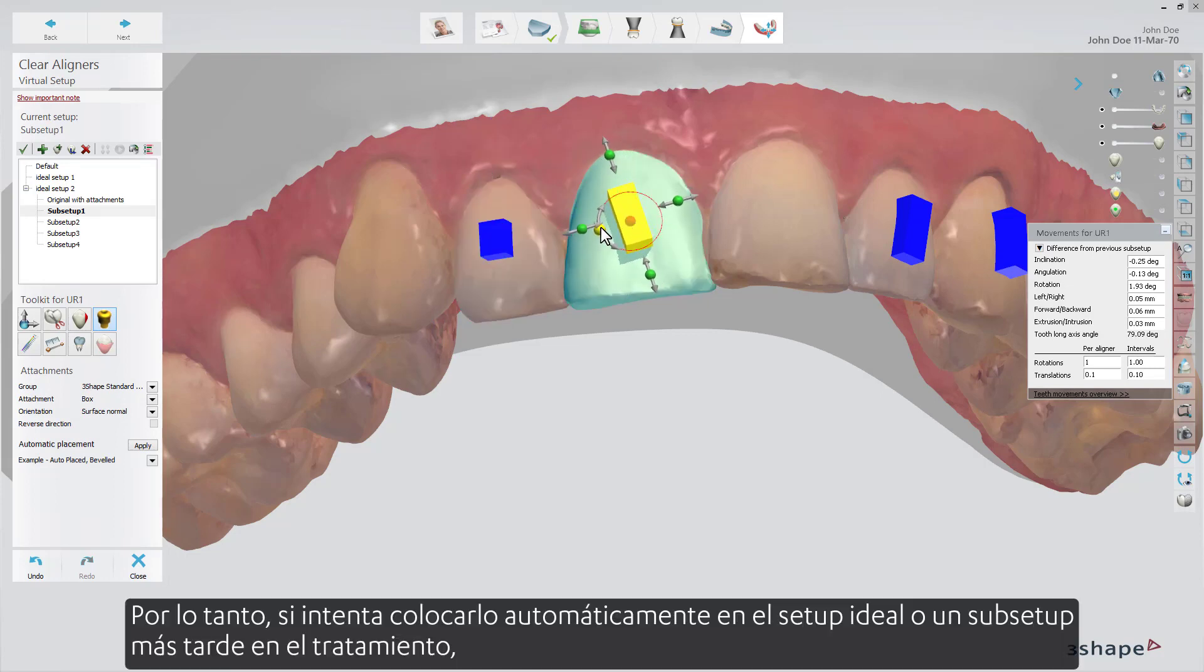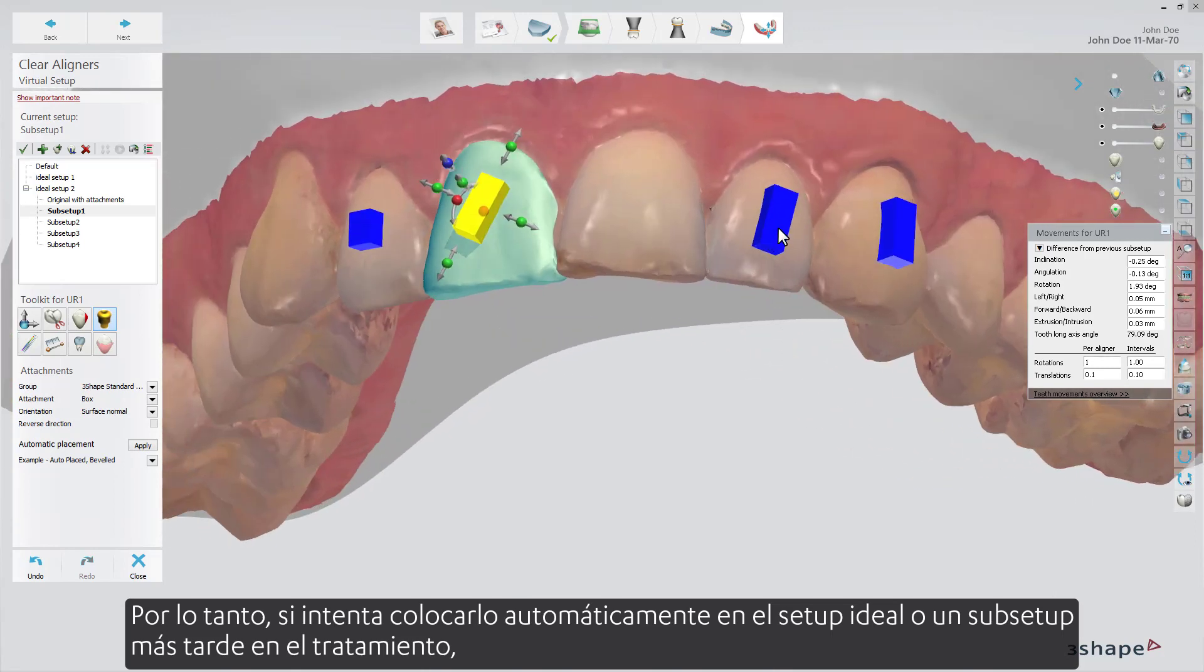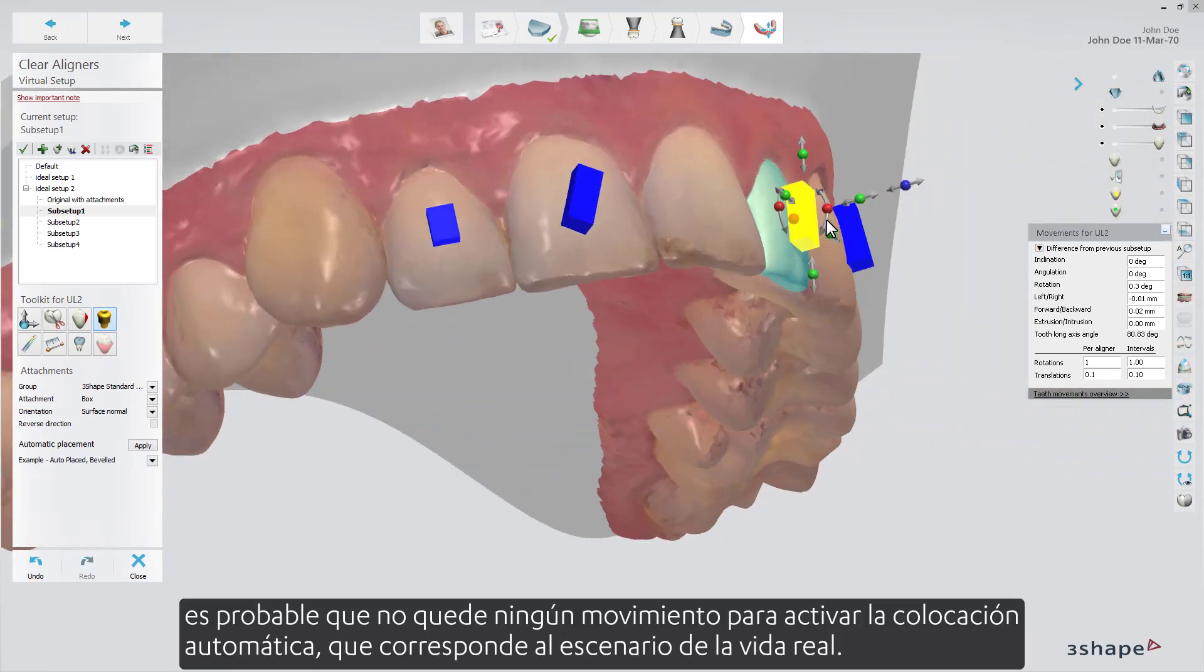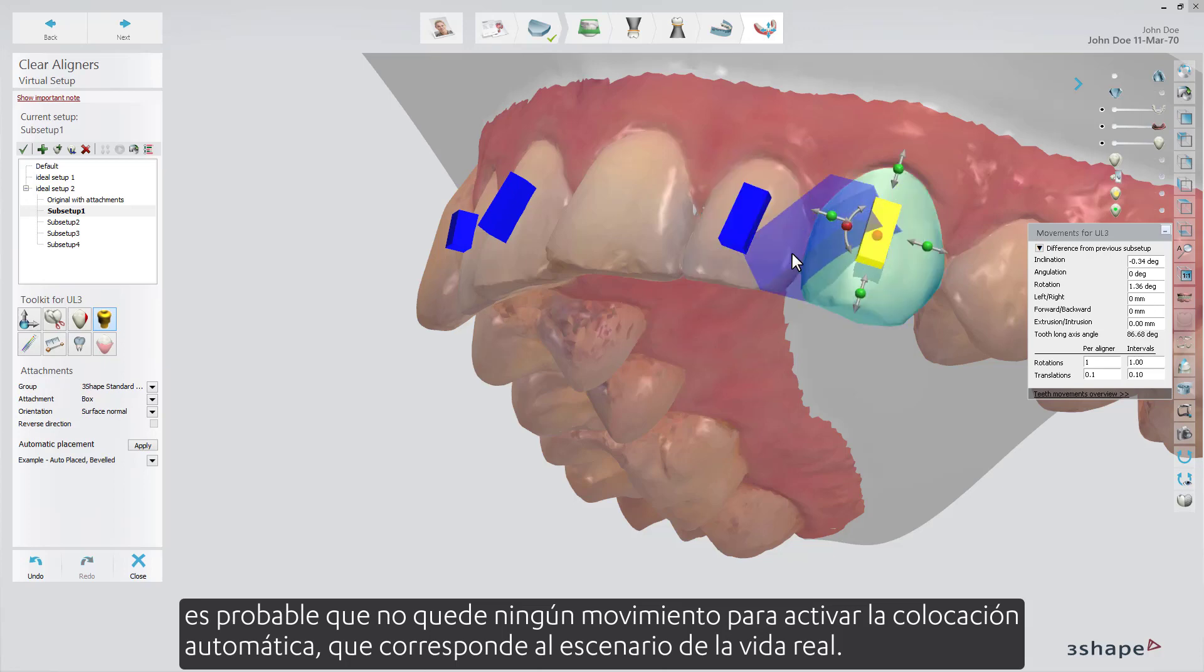So, if you try to auto-place on the ideal setup, or a sub-setup late in the treatment, there likely won't be any movement left to trigger the automatic placement, which corresponds to the real-life scenario.